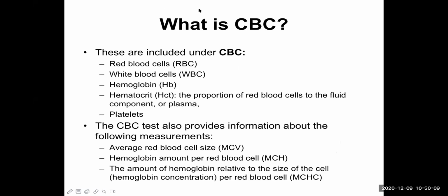See that. What is CBC? CBC means complete blood count. This is a very essential part of our investigation. Whatever happens to the patient, especially fever, if you suspect infection or inflammation, you always order CBC, always. And not only infectious disease, in so many chronic conditions in the body, we order CBC just to make sure what is happening to hemoglobin level, what is happening to total count, what is happening to platelet and things like that.